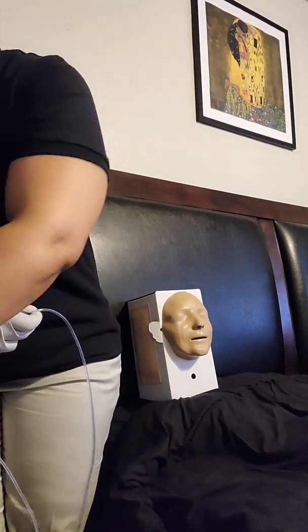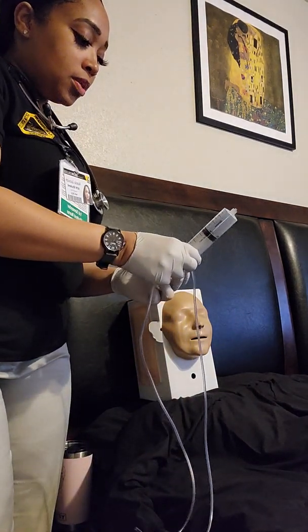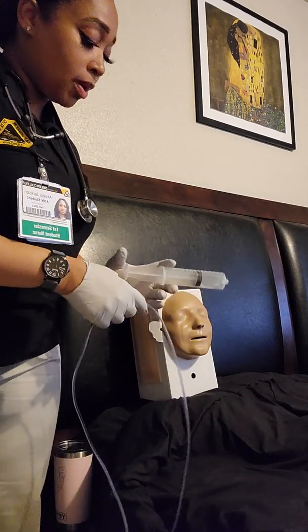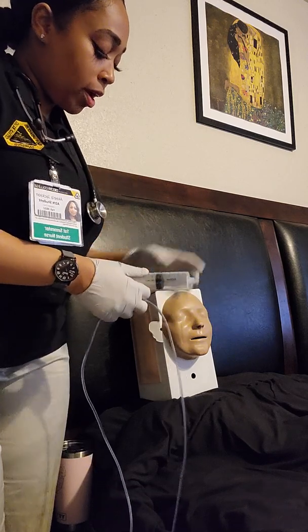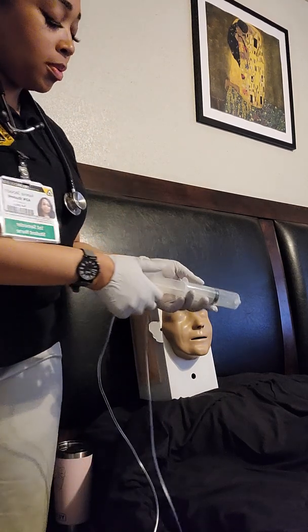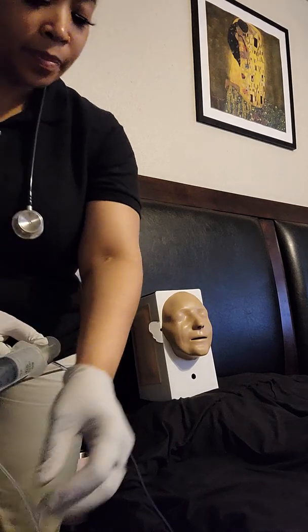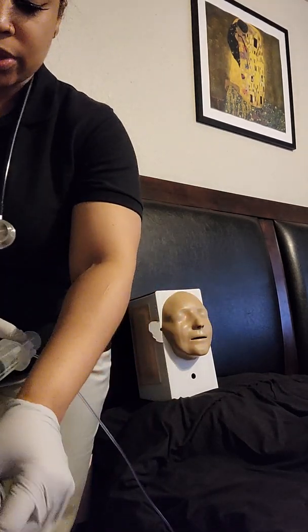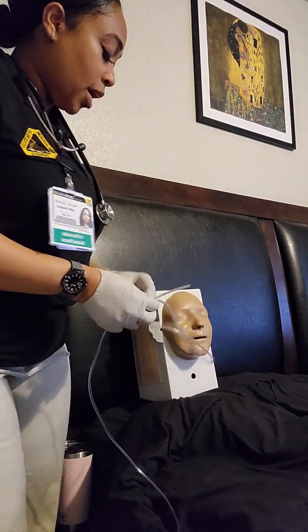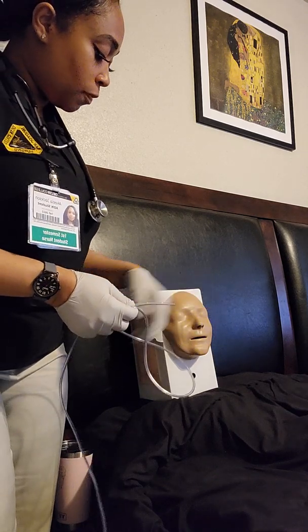Perfect. All right, I also have a piston syringe. I'm going to add 30 mLs of air. So I'm going to use this, once the tube is inserted, so that way I can listen to see if I hear air go through the tube. Then I will know that we are in the appropriate place. I'll also draw out some of your gastric juices and measure it with my pH strip so I can make sure we are getting gastric juice and that we're in the right area. And after the procedure, we will also have a radiology tech come in and take an x-ray of your stomach to check for proper placement.